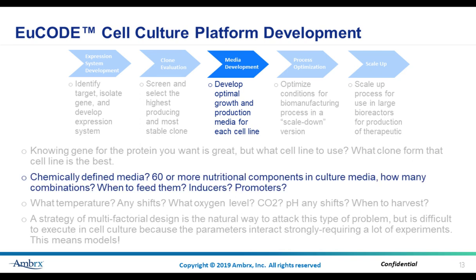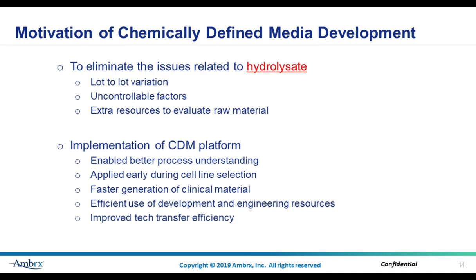So many commercial media are ready to use. Hydrolysate is so powerful. Do we still want to develop chemically defined medium? How can we identify the components in culture medium? How many combinations? When to feed them? How about inducers or promoters? These are the questions we need to answer one by one.